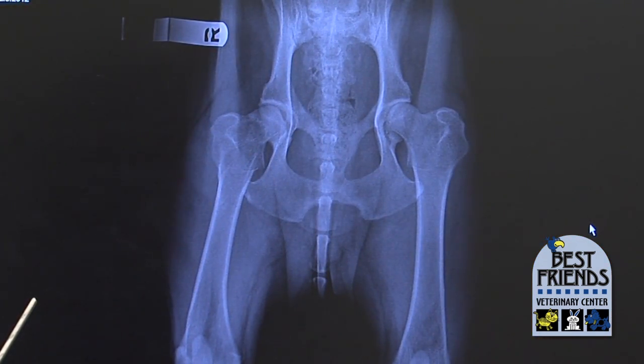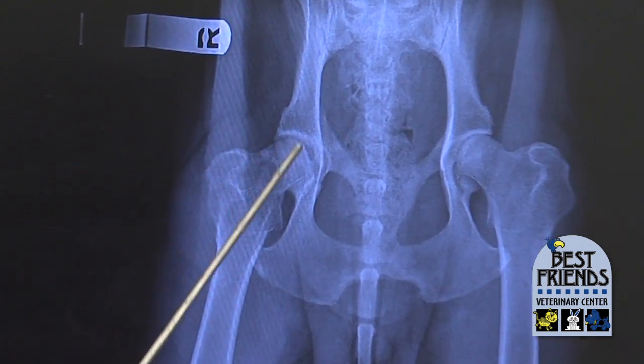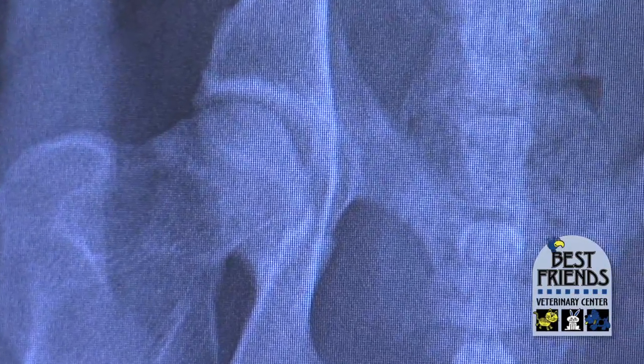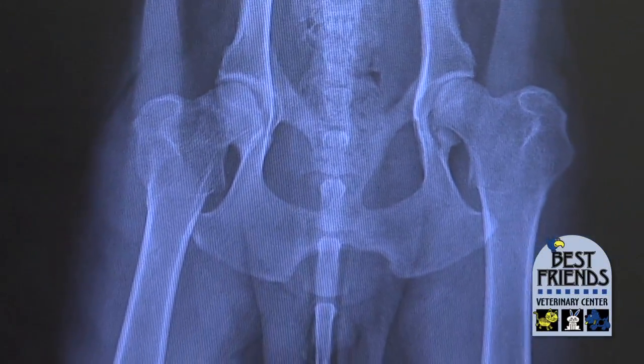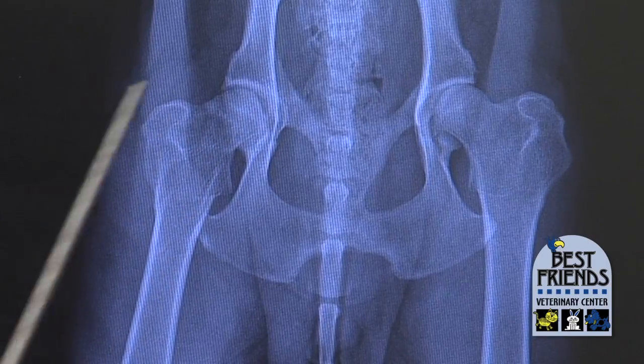This x-ray is of a slightly older dog and his bad hip is just like the one we just saw, but his is more advanced — he's been dealing with this problem longer. When a pet has arthritis the bone gets lumpy, so if you have arthritis in your hands your knuckles are going to look big and lumpy. The more arthritis there is in the joint, the bigger and lumpier that bone is going to look.